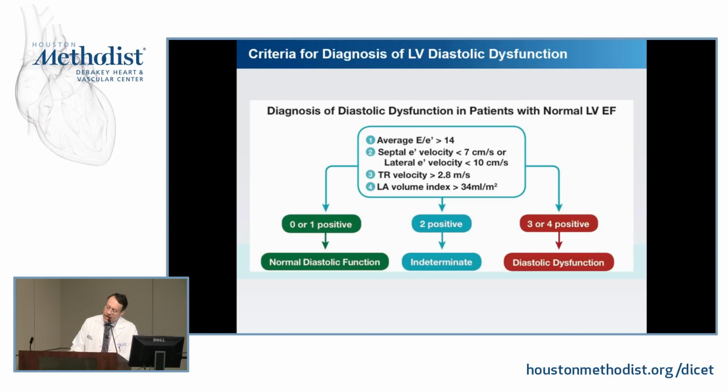The problem with the age-specific cutoffs is if you try to group a number of studies together and then do some sort of meta-analysis through these and then come up with the values this way, you end up with wide confidence limits. So the consensus of the writing group was this alone by itself should not be used to define an abnormal function. How about then other variables?